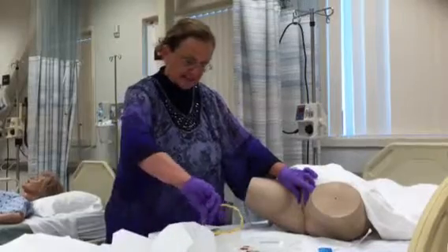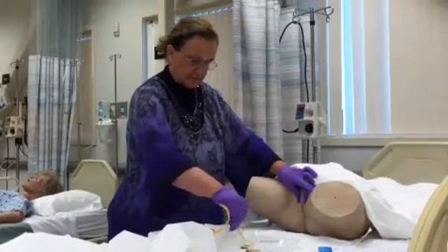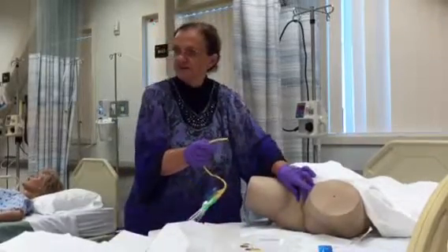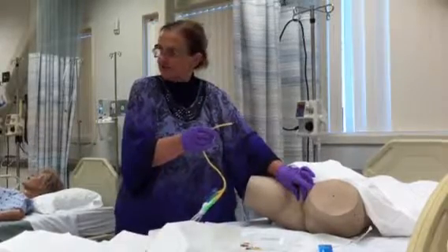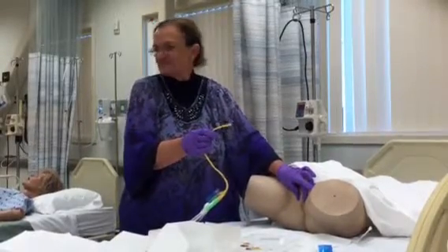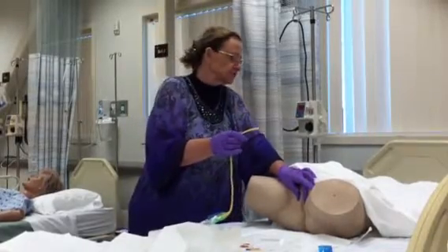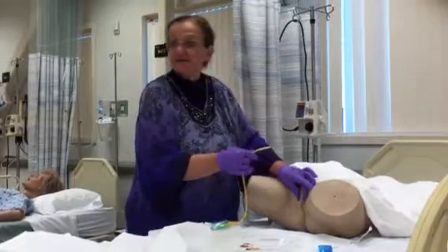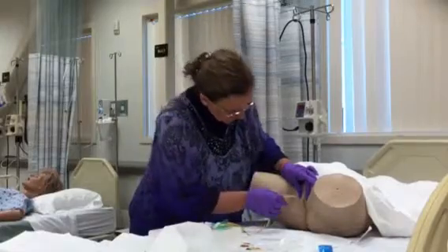So now I'm going to take my catheter and I'm really going to goop it up. And I'm going to let my patient know I want them to take some deep breaths in and out, to relax and also to distract them. It doesn't really hurt. It's a little uncomfortable. Could you please just take some deep breaths in and out? I'm going to put a tube in, and it's going to feel a little bit cold as it goes in.